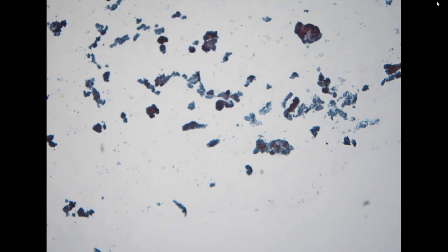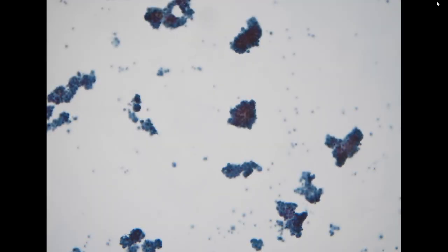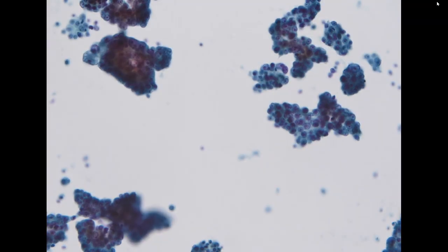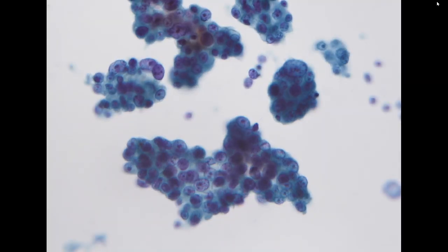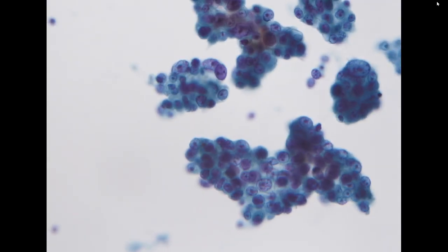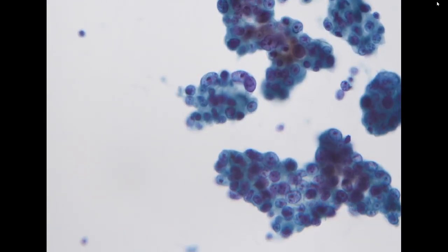Lung is the most common organ for distant metastasis, and this is again a different pleural effusion specimen. The patient has a prior history of gynecologic cancer, an endometrial cancer, and she has received multiple surgeries and has multiple metastases. In this specimen, we can definitely tell that it is adenocarcinoma.